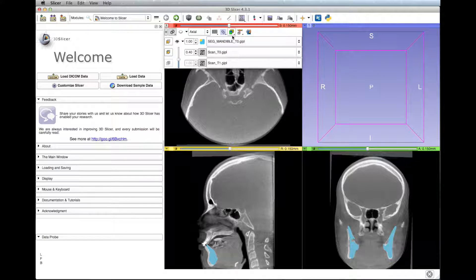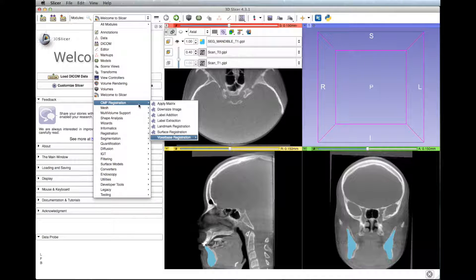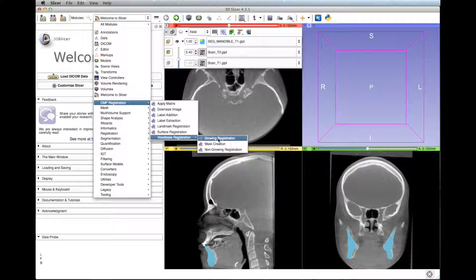To start the voxel-based registration, go to modules, then search for CMF registration, then search for voxel-based registration, and finally growing registration or non-growing registration, depending on how old the patient is.